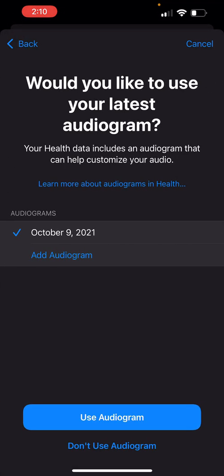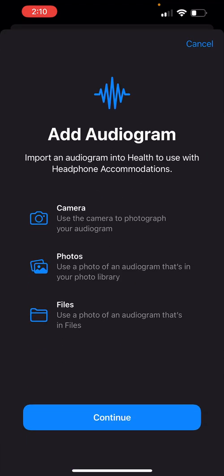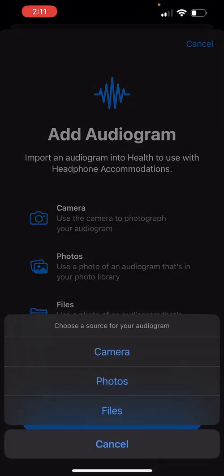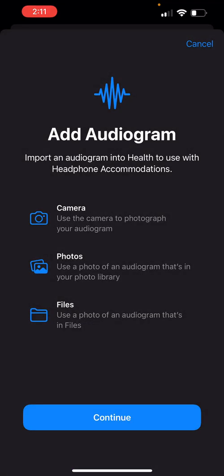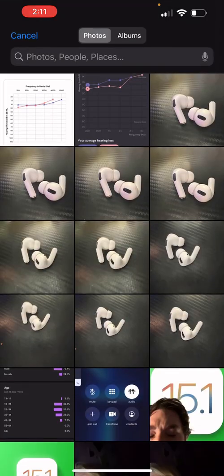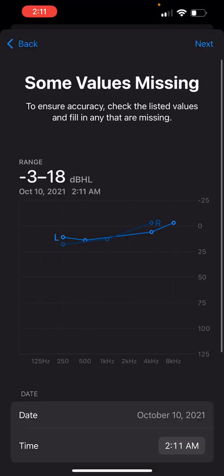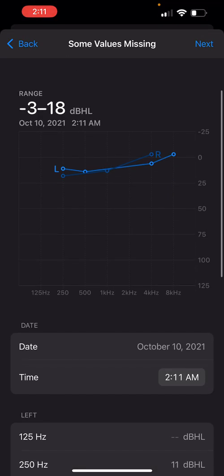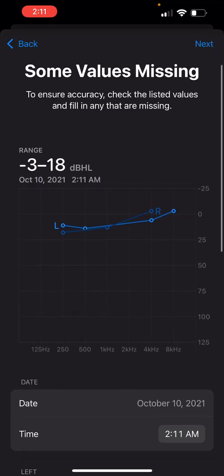Now, as you can see, I already have an audiogram here, but in this case, you're going to add audiogram, Photos, select a photo of the audiogram, and here you can see it shows you the audiogram.